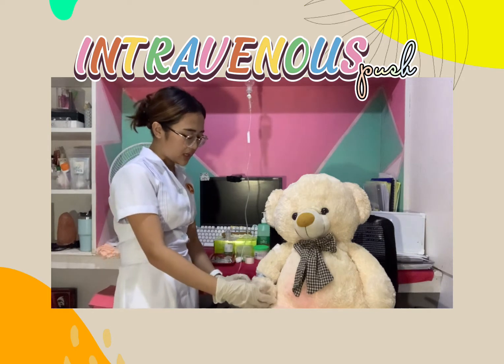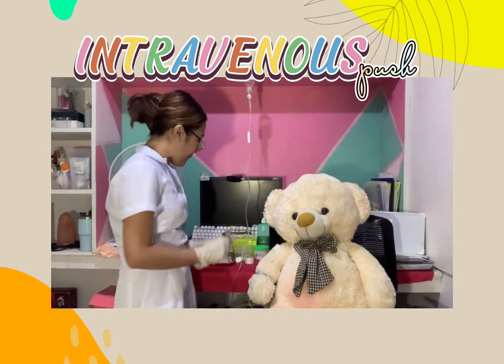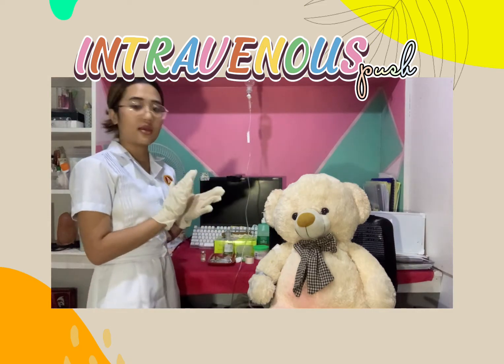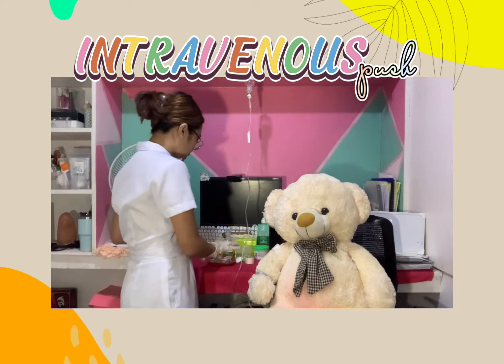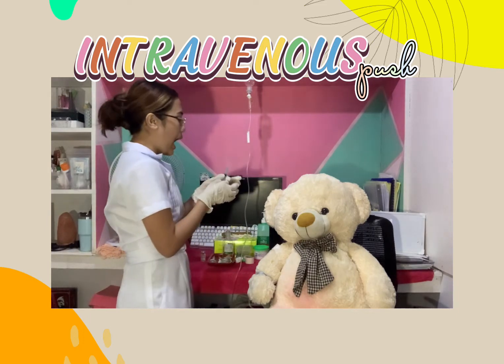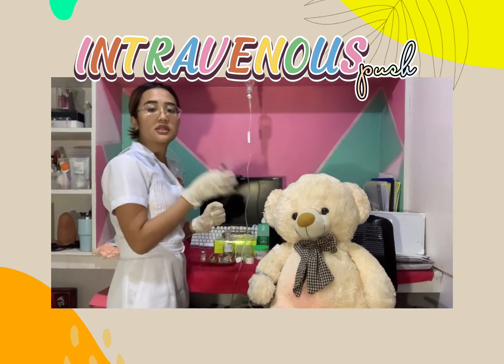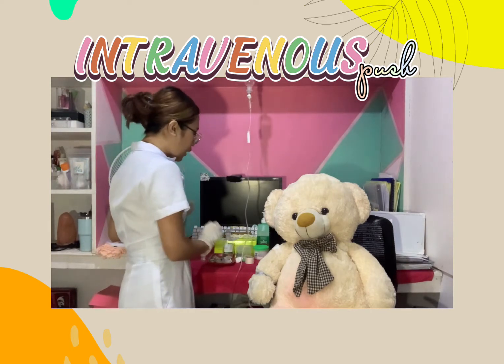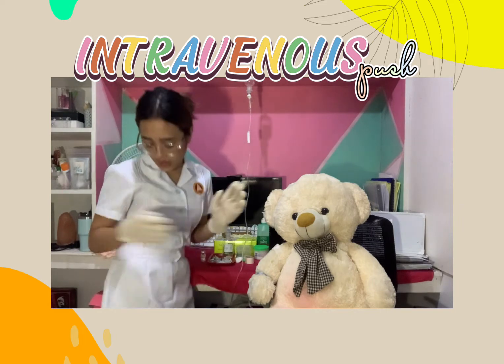So, in here, for the IV lock, we need to make sure first to prepare the medication. We will prepare the syringe. We need to make sure that we have a syringe with 1 ml of sterile water. So, it is already prepared. So, now, we can start on the steps for the IV lock.